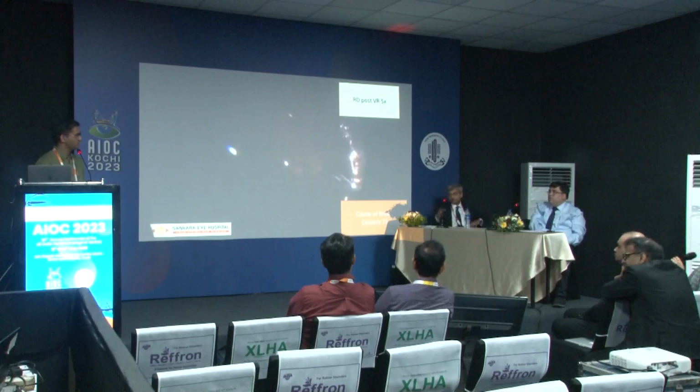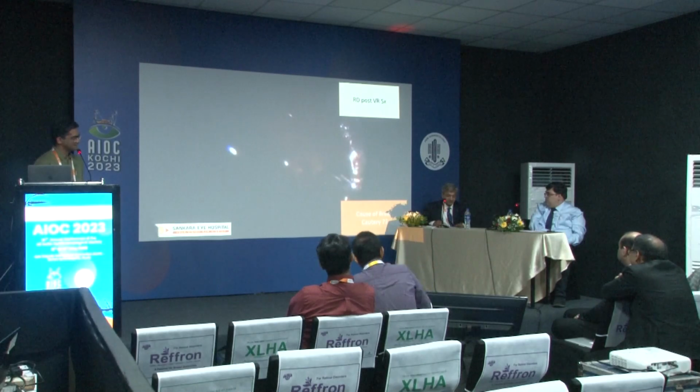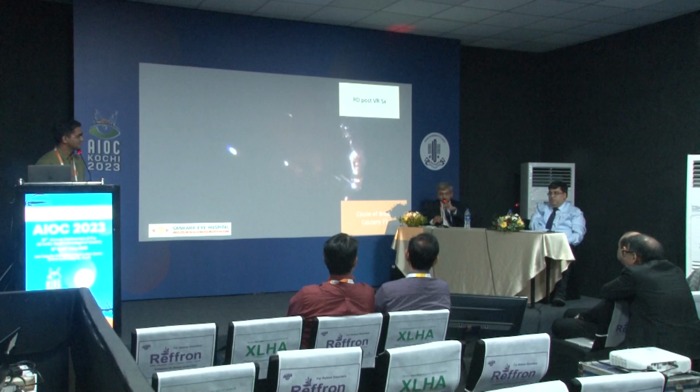Yeah, that is also one. We all end up saying we use laser instead of cautery, and laser induced hemostasis is sometimes not achieved. I think it's long duration and low power that you need.